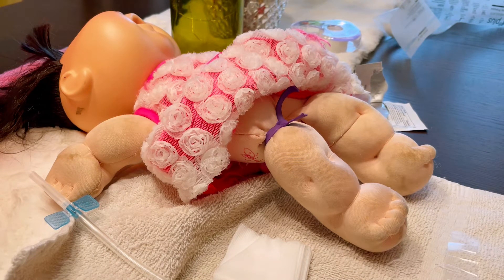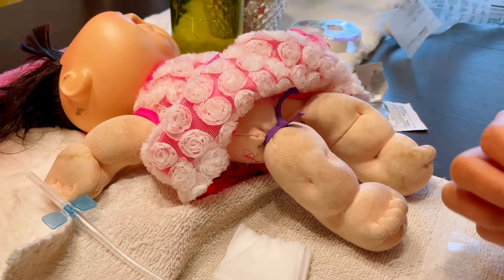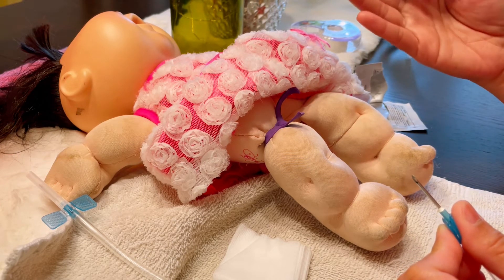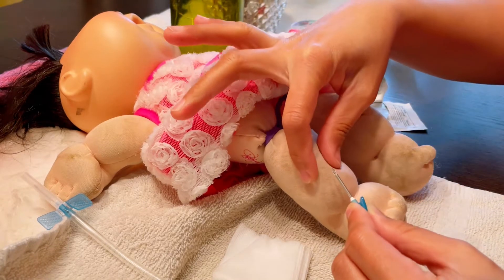Now I'm ready to cannulate the patient. If the patient tells you they have a preference for where to be stuck, check first for aneurysms. If an area looks shiny and dark, avoid it — those spots are prone to prolonged bleeding at the end of treatment. Educate the patient: explain that you need to stick where it's not shiny or dark, because they may bleed longer there. You are their advocate.